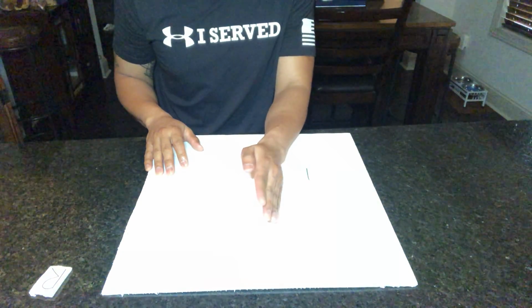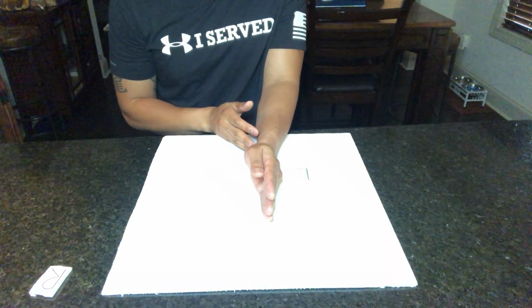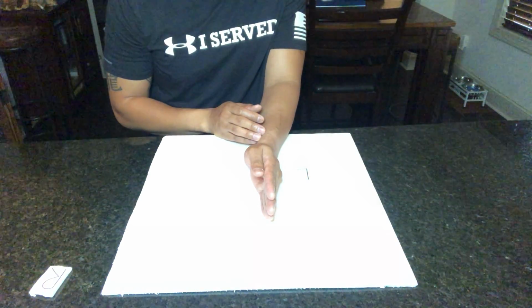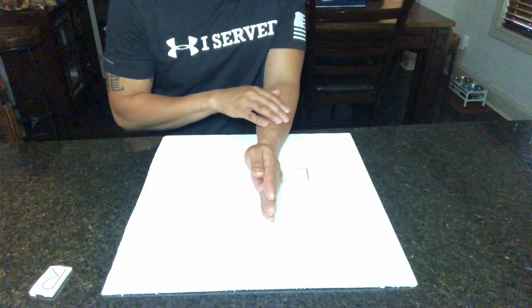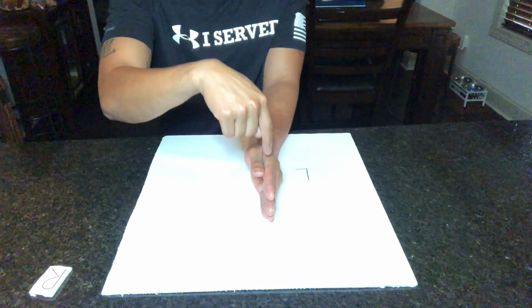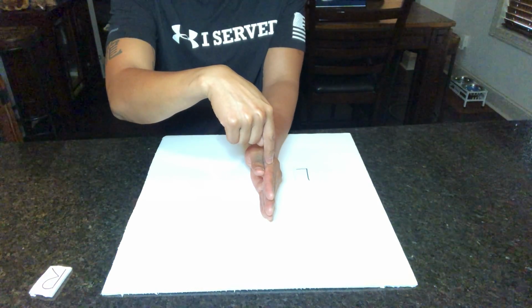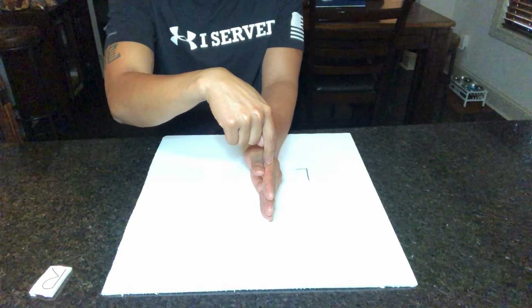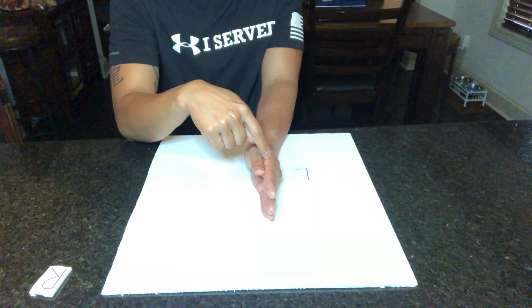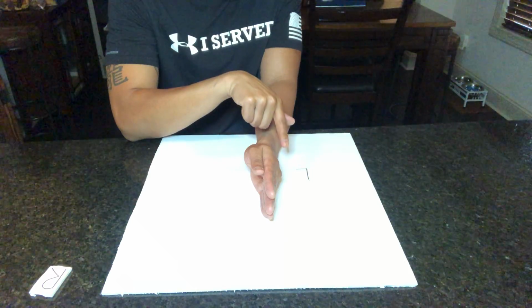You're going to have the patient rotate the hand up, lateral, and here we're looking at 40 SID, 10 by 12 cassette. Central ray is going to be perpendicular to the metacarpophalangeal joints. With this particular projection, we're going to see structures of the carpals, metacarpals, phalanges, and distal end of the radius. And the ulna are all going to be superimposed in this projection.